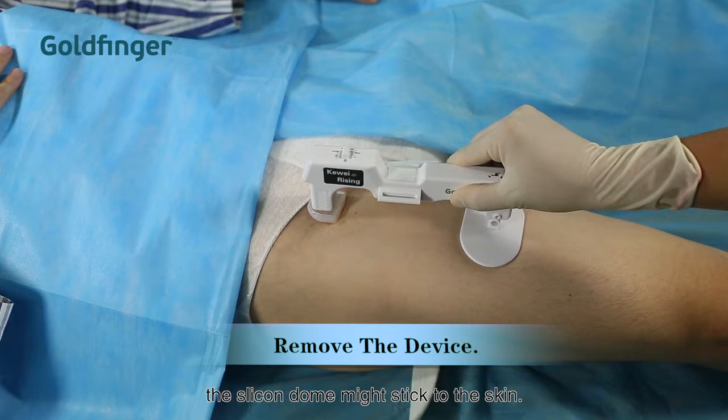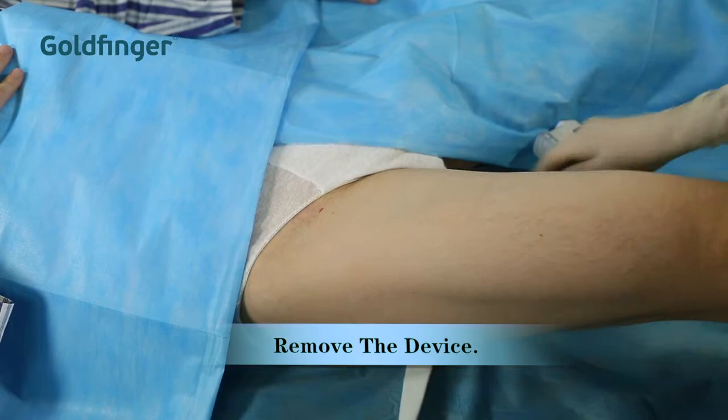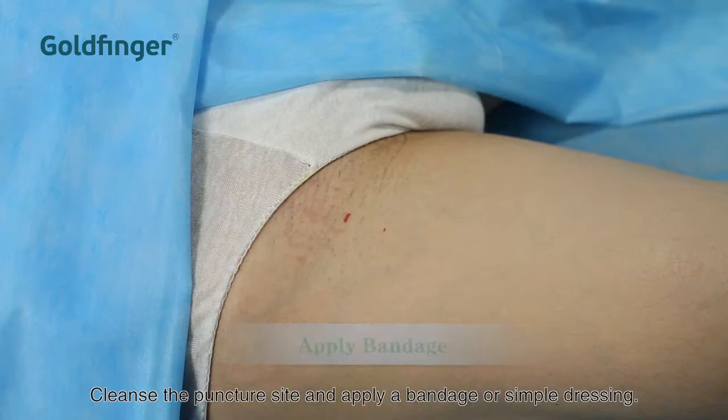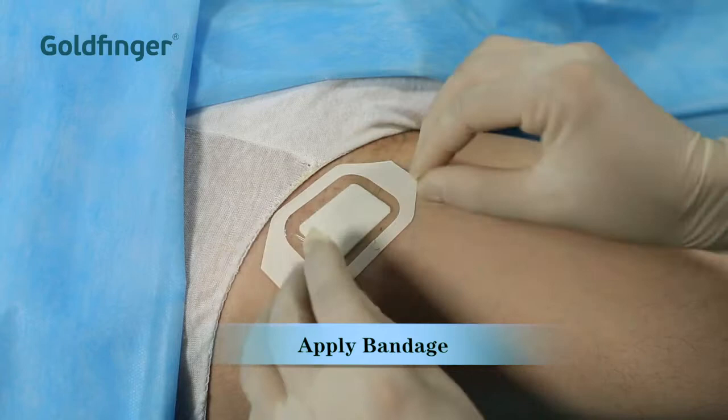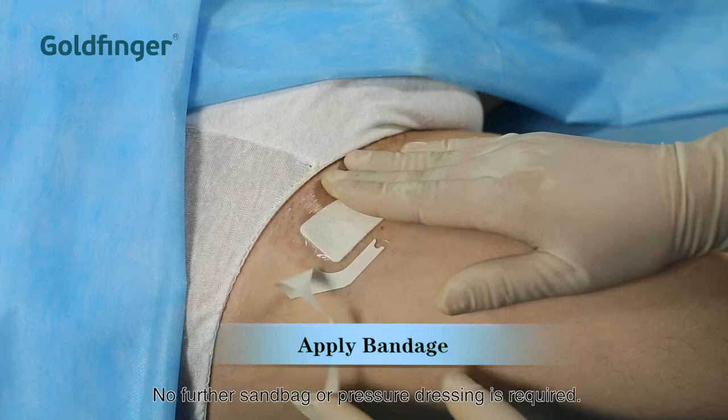After extended periods of contact, the silicone dome might stick to the skin. An alcohol swab inserted under the dome, as it is being removed, will facilitate easier removal. Proceed gently to avoid opening the wound. Cleanse the puncture site and apply a bandage or simple dressing. No further sandbag or pressure dressing is required.